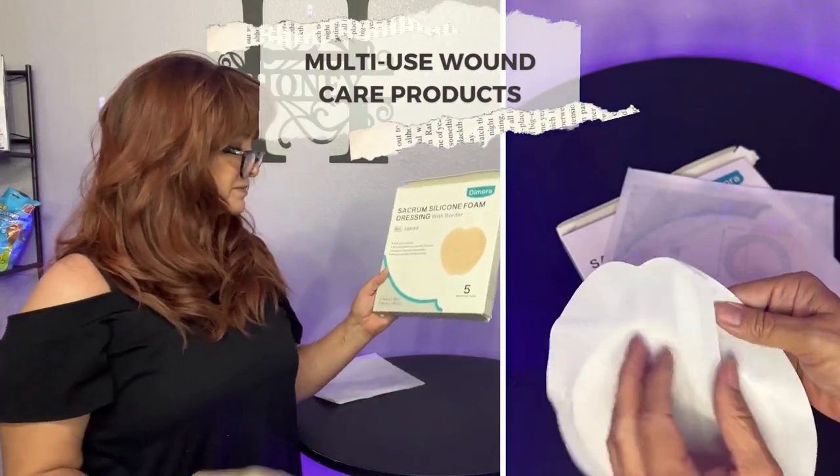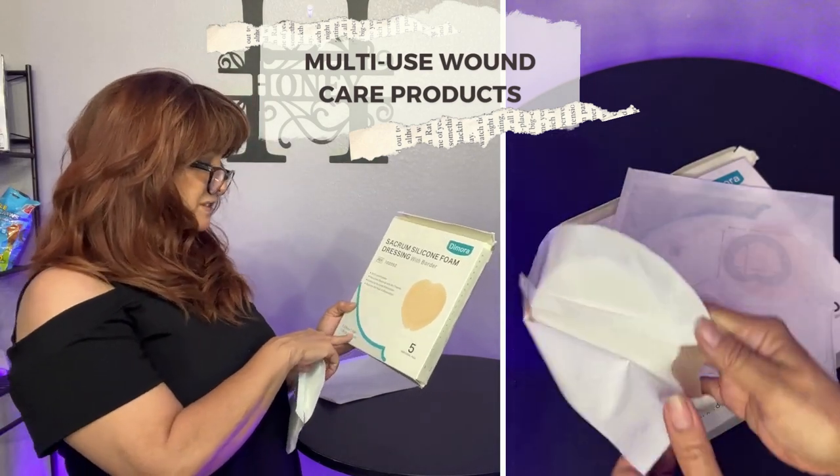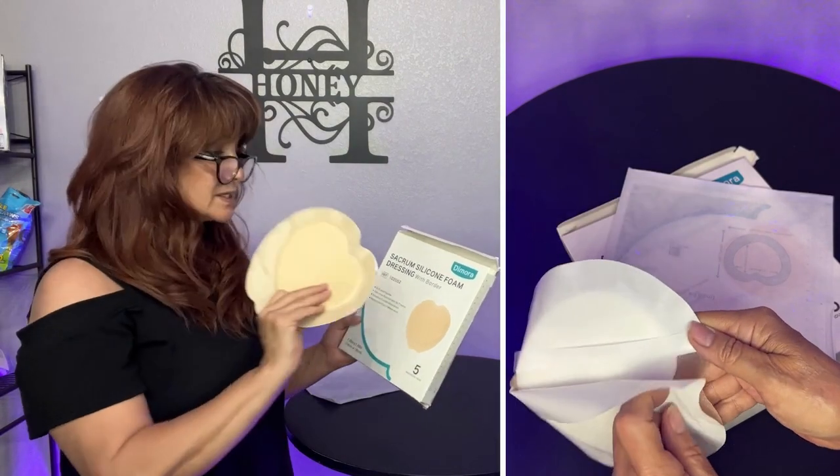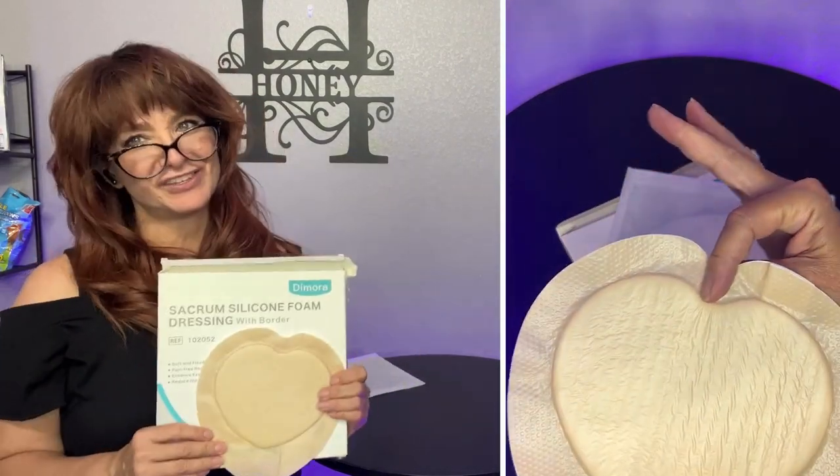Each pack comes with five, and this is seven inches by seven inches — a pretty good size, seven by seven, covering all the way across and all around. Thank you, Damora.